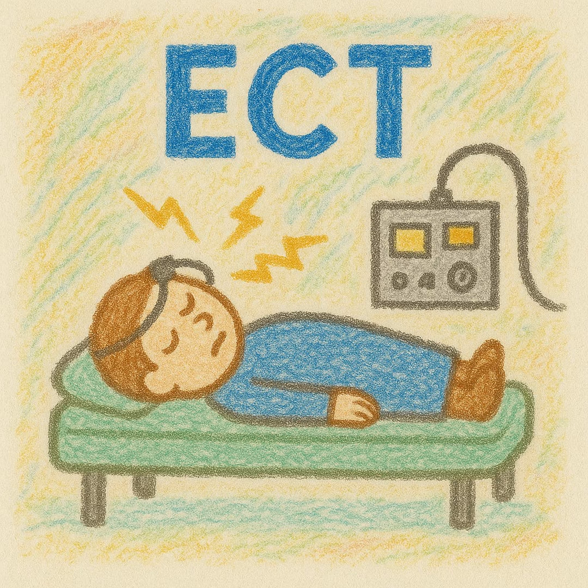Oftentimes, we might start at the low end of that, and if we're not seeing good seizures, or if we're not getting the clinical outcome we want, we're going to creep up toward the 2.5 times. And sometimes, this is just a guideline, you might go up to 3 times or more potentially, but you're going to see more side effects as well as you go up.